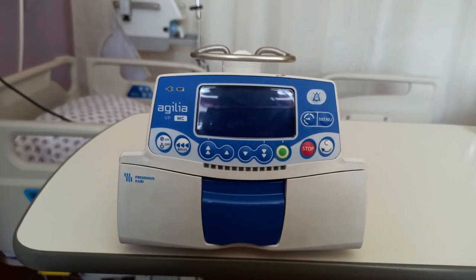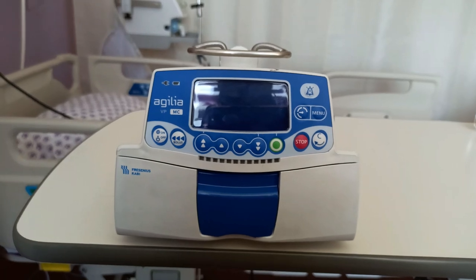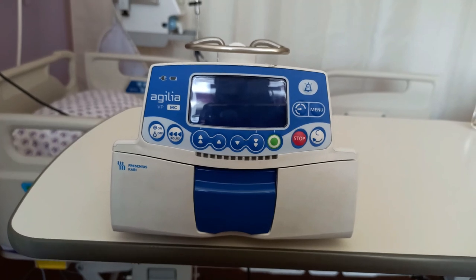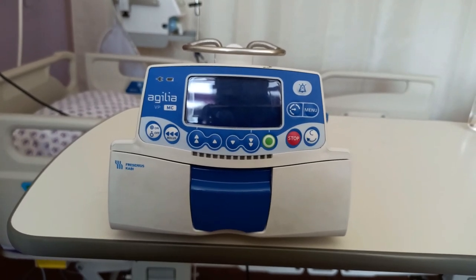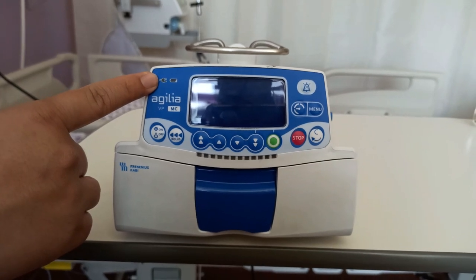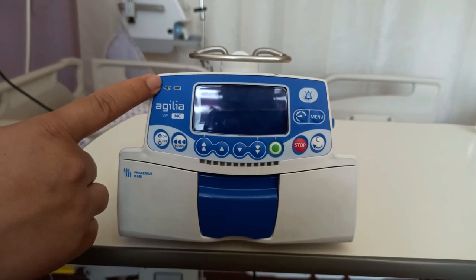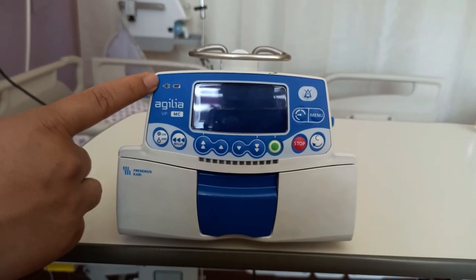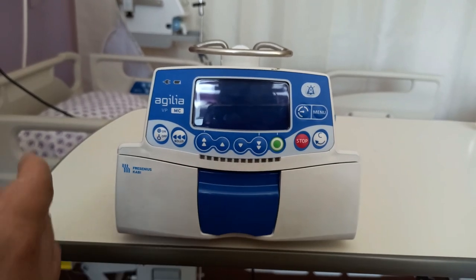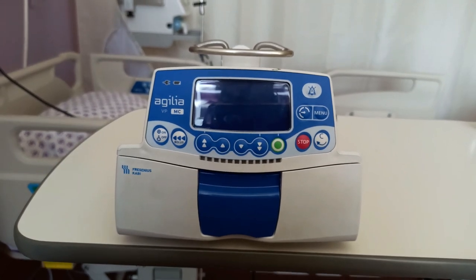There is a bolus button used for providing boluses or priming the infusion set. The other buttons are the menu, pressure, and one to silence any alarms. There is an LED which shows a yellow light when the equipment is powered on, and an array of LEDs that indicate whether an infusion is in progress and whether there are any alarms.